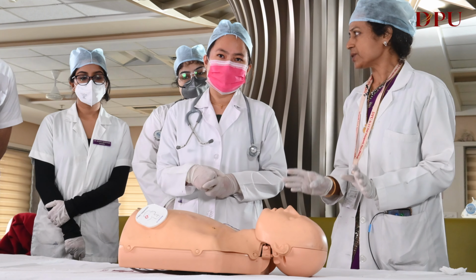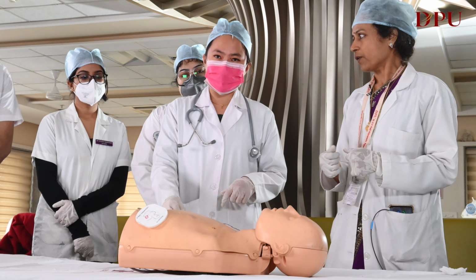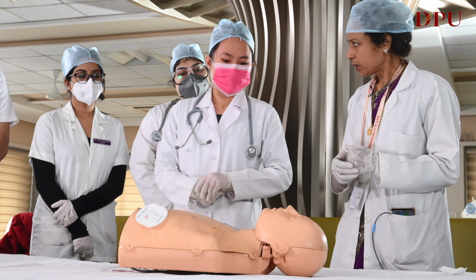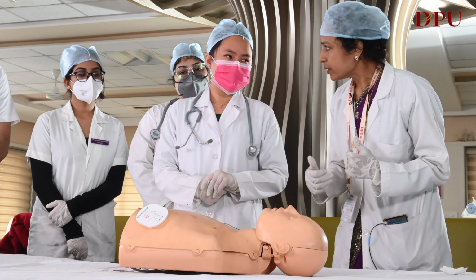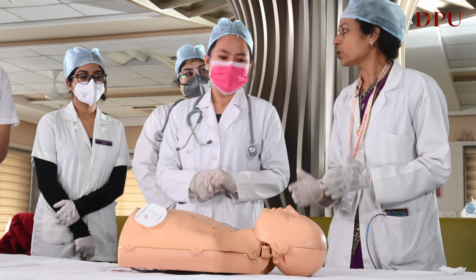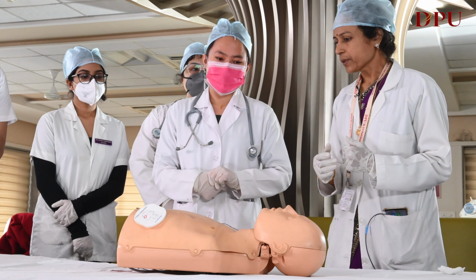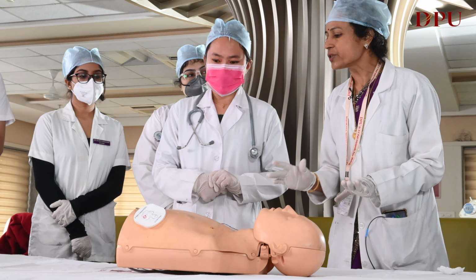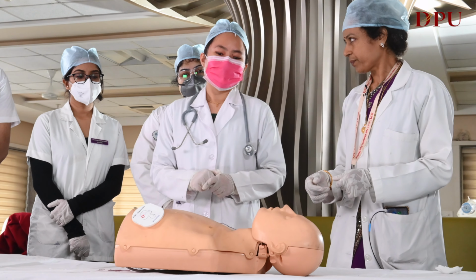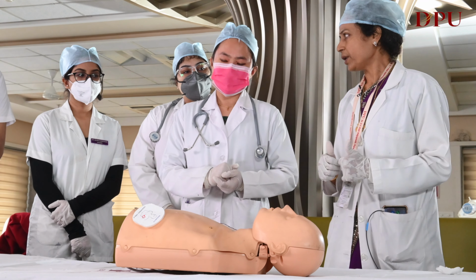If the machine says it is a shockable rhythm, then you are going to shock. Before you press the shock button, you will make sure that I am clear and everybody is clear. Nobody should be touching, otherwise you will also get an electric shock because our bodies are conducting. After making sure that nobody is touching, you will press the shock button. After that, you will resume the chest compressions.